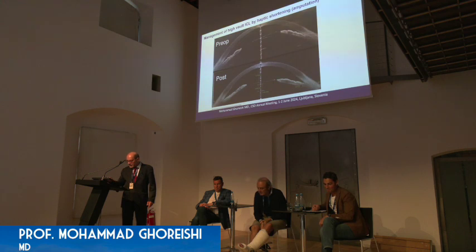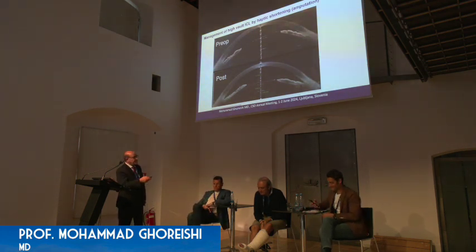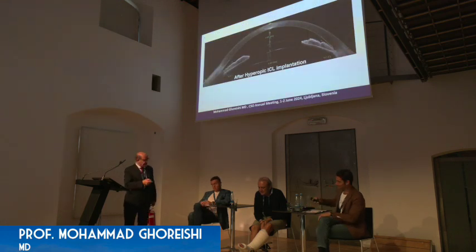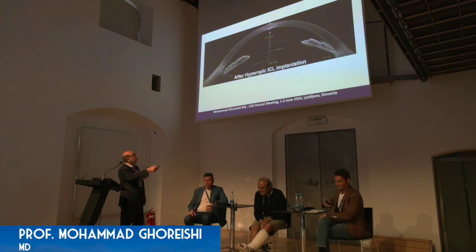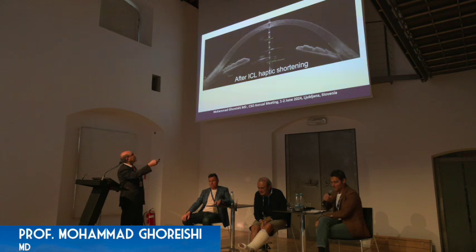This is one case before operation and another after the operation. This is hyperopic, and as you see here, the angle is almost closed. After the operation, at least the angle is open here.